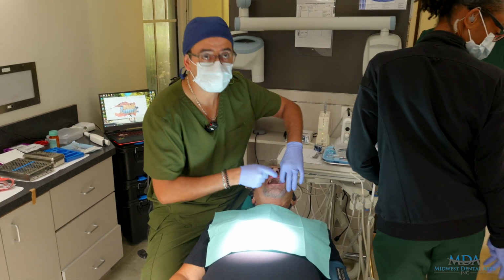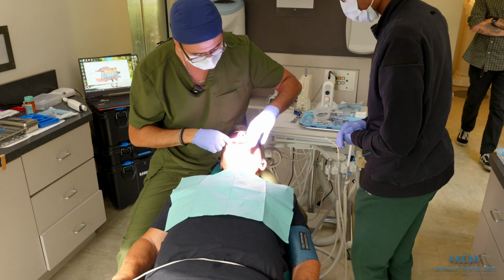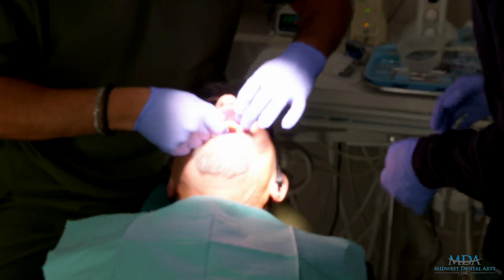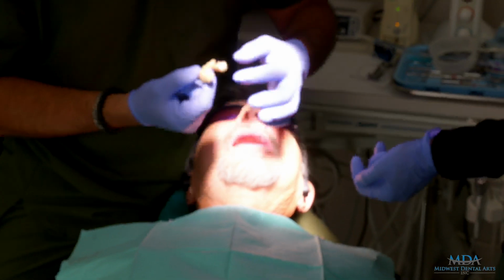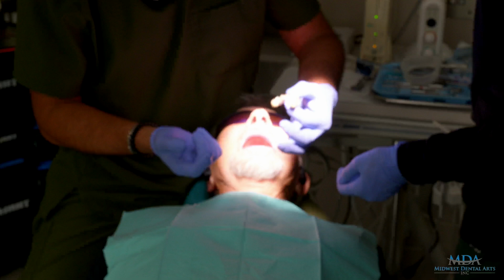So in this case, now we've taken all the initial records of the temporaries that we have. We're gonna remove now this temp that he's been carrying for quite a while. It has no use, no purpose now. I mean, it's done its job for a while.